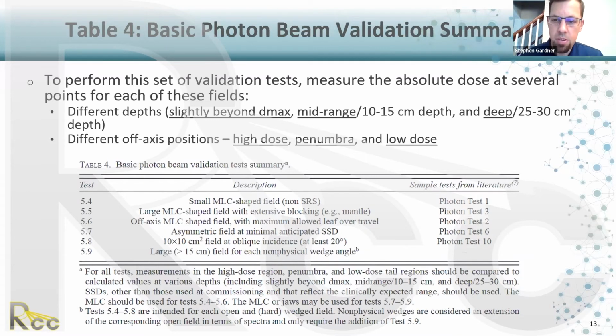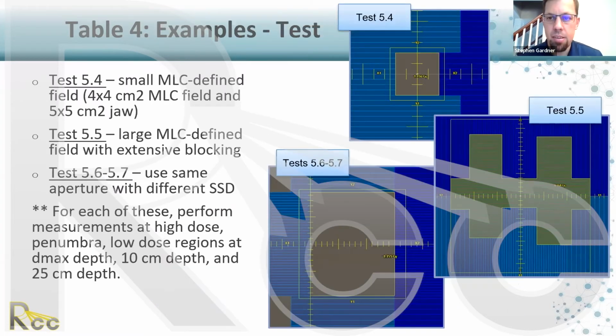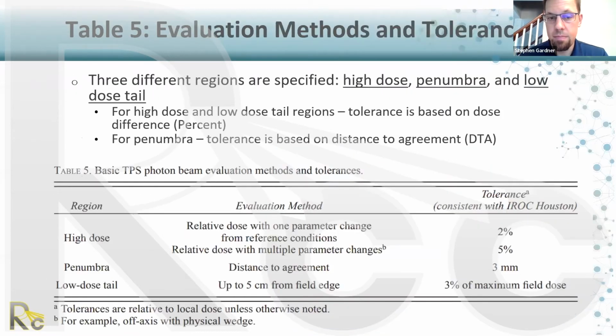Okay. There are some other samples in the literature, and then you have the MLC aperture from these slides. So hopefully that helps if you do these tests. And you can create your own tests that satisfy these conditions. It's very open-ended, but you can also use something very similar or the same as these.